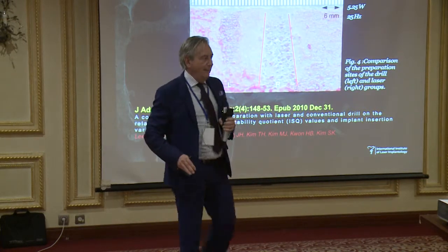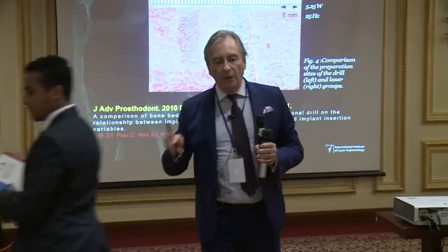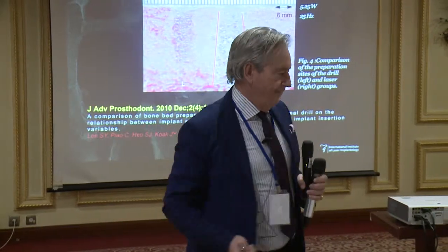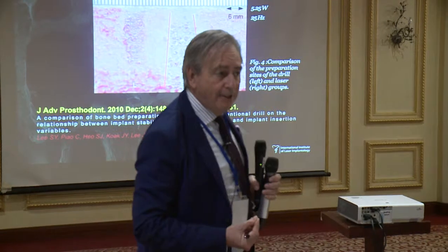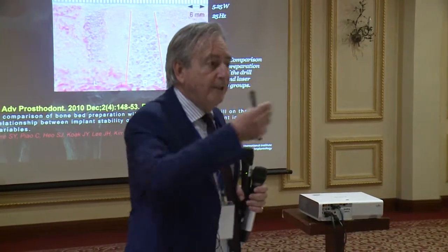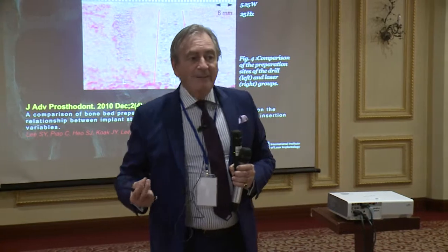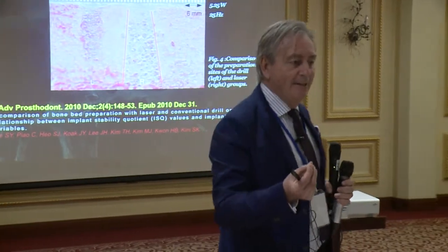Here, and I'm sure that a lot of you are doing endodontics as well. What happens in endodontics if you're using a rotary instrument? You're closing the tubules, right? And if you happen to use an erbium laser, what happens? You open these tubules. You clean your canals, all the openings.